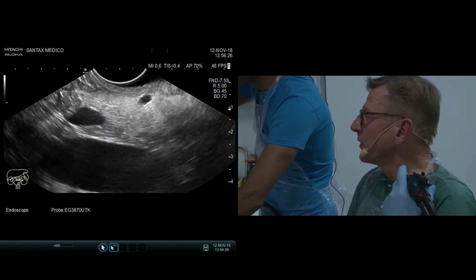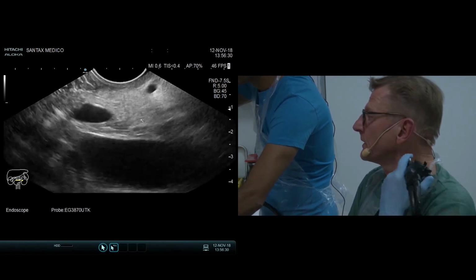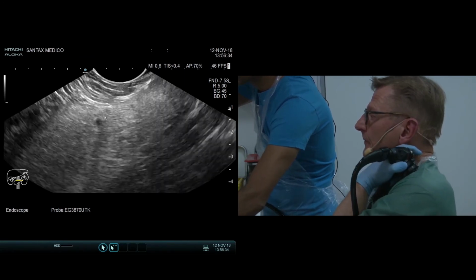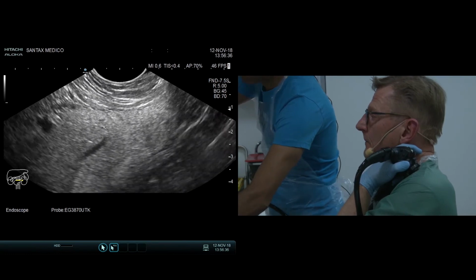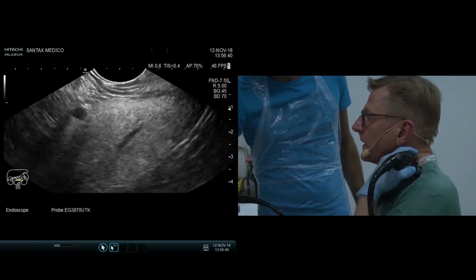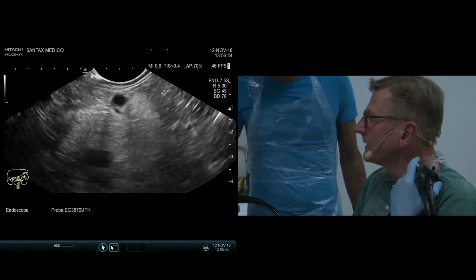And now we approach the cystic lesion there, I think. That's the corpus of the pancreas. And here you have the pancreatic duct again, and then I think I went out.